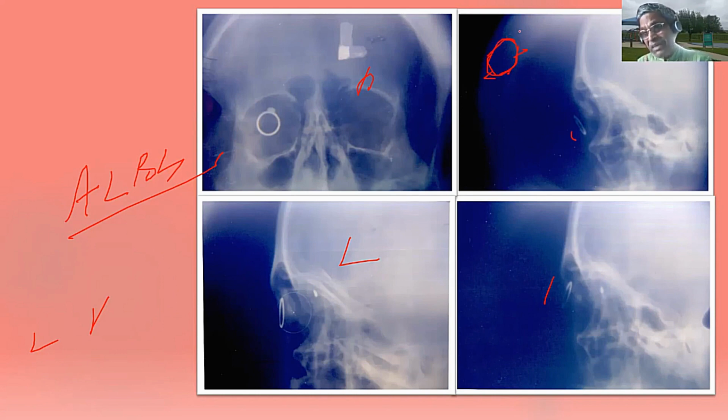Exam question: they will ask you what this limbal ring is made of. If it is made of what material, doctor, don't say steel at all. Your answer is silver. What is the diameter of the ring? Your answer is 12 millimeters. You know, the cornea diameter is 12, so naturally 12 millimeters is the diameter of this limbal ring. What are you going to do? I suture the limbal ring around the cornea, around the limbal area, sir, and take a PA view. Once I take a PA view, I can see a radio-opaque material, so the foreign body is going to be localized.